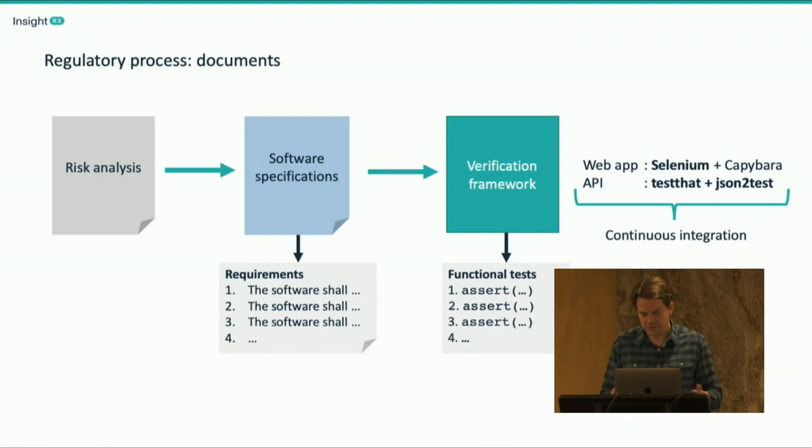And for that, mainly for the unit tests, we use testthat, as I'm sure a lot of you are also using. But I want to focus on one other thing, which we developed in-house, a package called JSON2test.